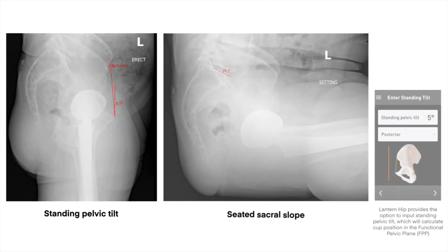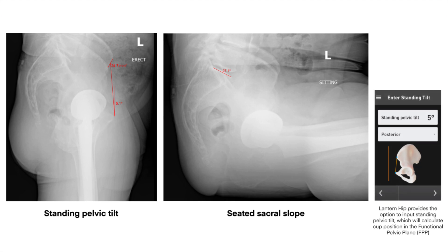In addition to the AP standing pelvic templates, I typically get a standing lateral pelvic and a sitting lateral pelvic image in order to assess spinal pelvic motion. Starting with the standing pelvic image, we're determining the patient's functional position. When standing, the anterior pelvic plane is tilted back roughly five degrees posteriorly. Looking at the sacral slope, it is about 29 degrees when compared to the horizontal, plus or minus a couple of degrees.